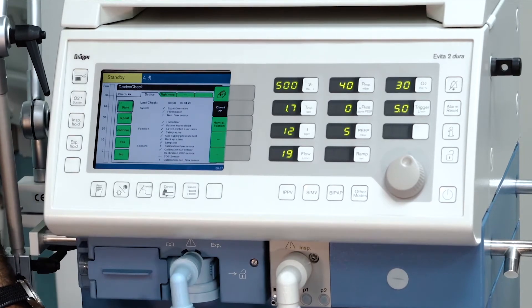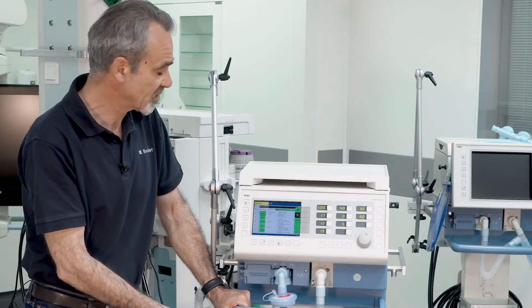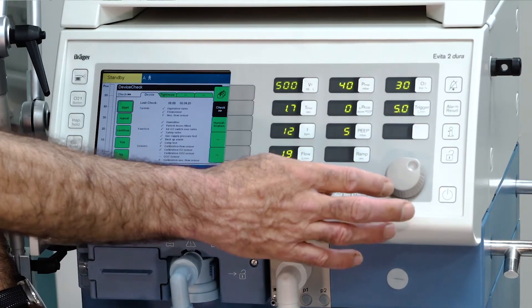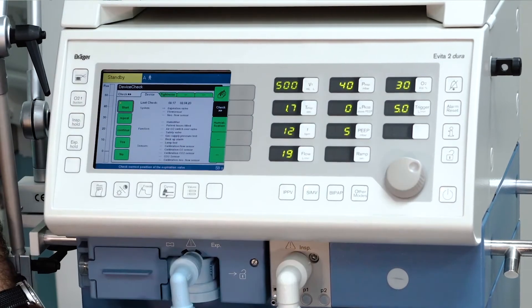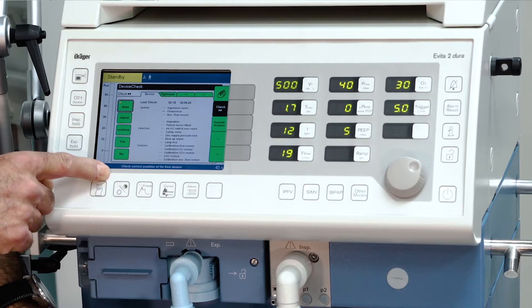Press check and confirm the beginning of the device check by selecting start with the rotary knob and confirm. Now follow the instructions on the bottom of the screen.